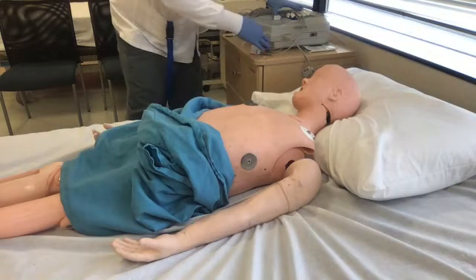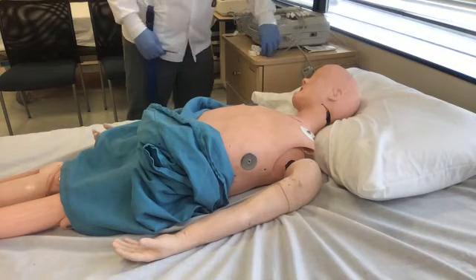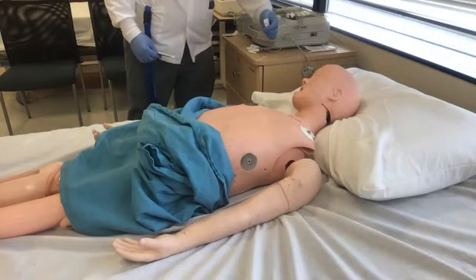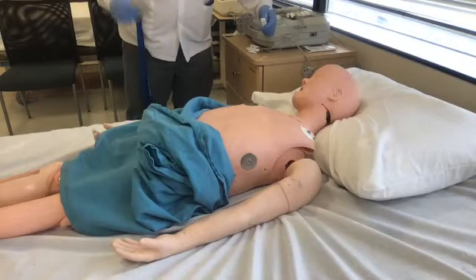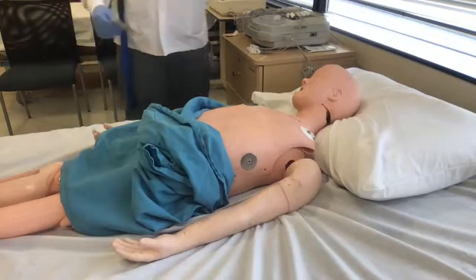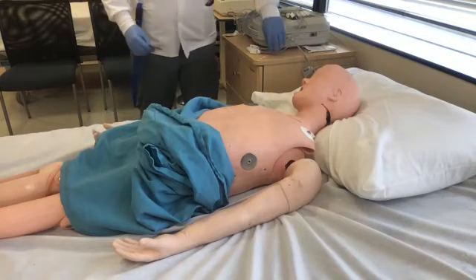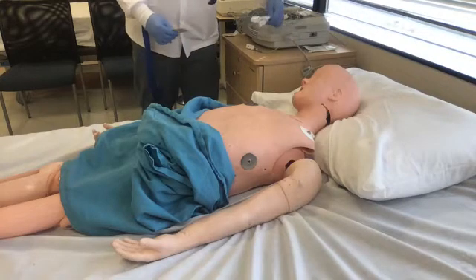It's called a Medusa when all the wires are tangled. This is expensive. These little alligator clips look cheap, but you can't buy them separately. You have to buy them in a pack, and the pack costs $140 plus, and that's the cheap stuff. If you're in a cardiologic center or internal medicine practice, they're going to buy the good stuff, which can run up to $500. So this thing shouldn't be dangling, because if it does, these things crack and break.